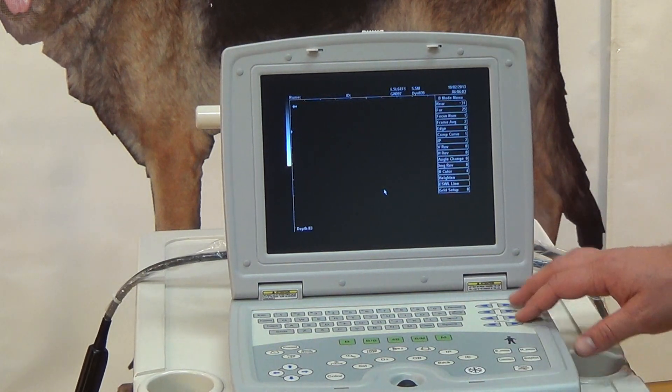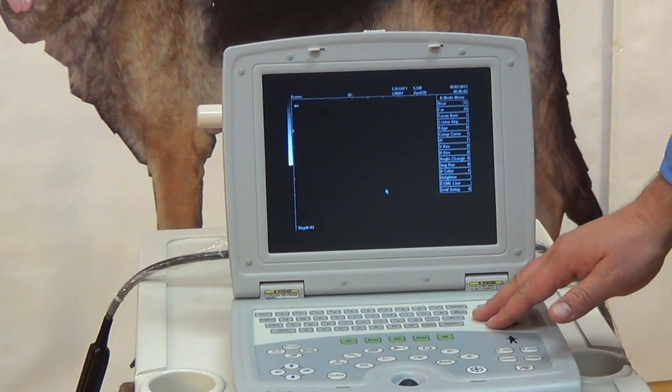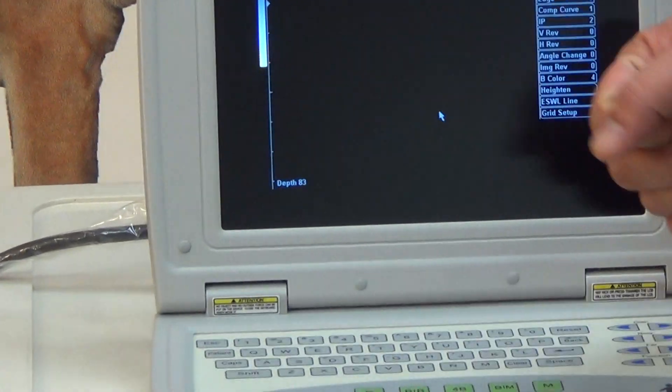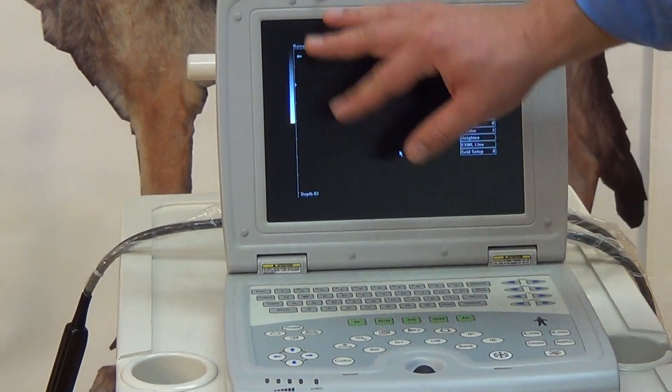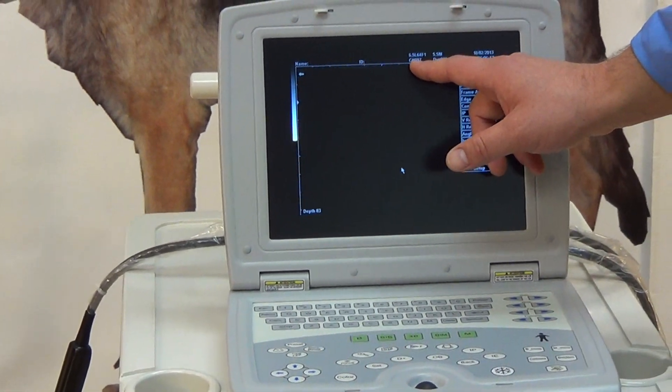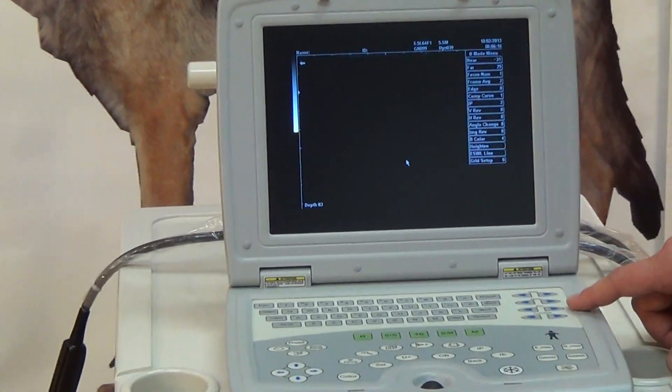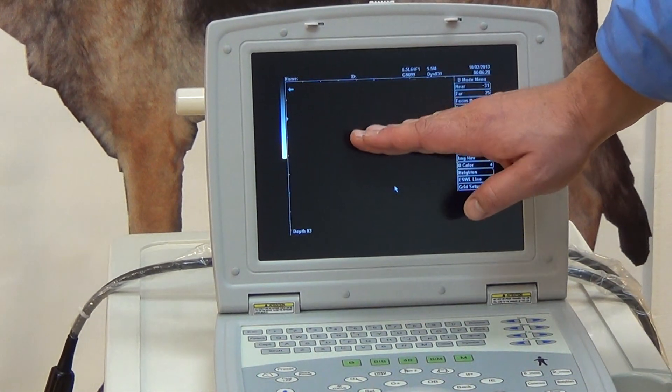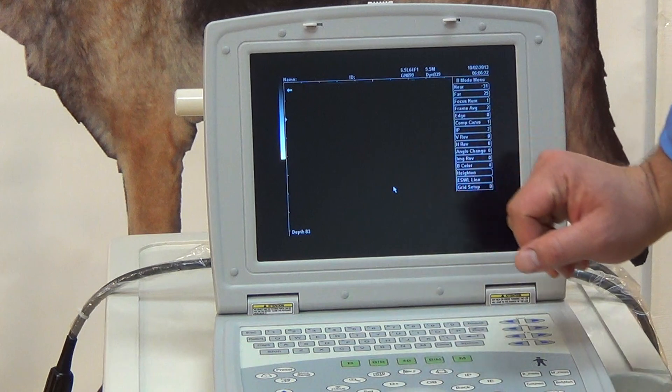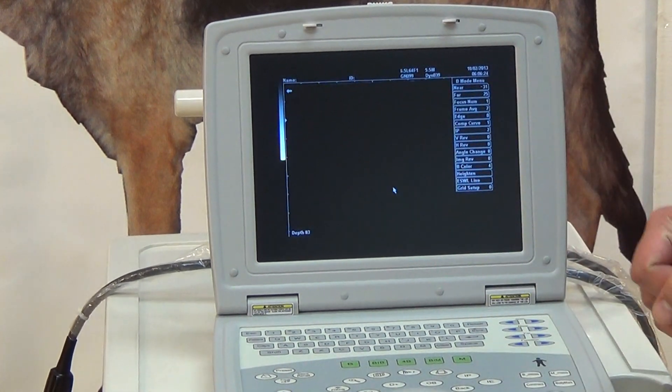Coming up to the right here, obviously the center is the keyboard. That's relatively self-explanatory. You have your settings for gain. So gain is overall brightness, and that's signified here, GN. You can increase the overall or decrease it. There's also a near and a far gain. So you can increase the gain on basically the top half or the bottom half of the screen, depending on what you're looking at.